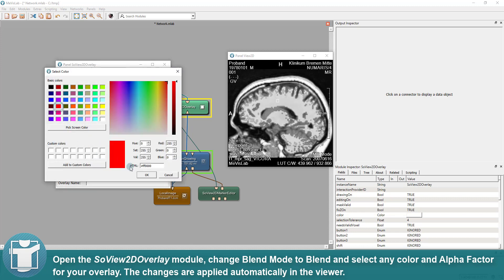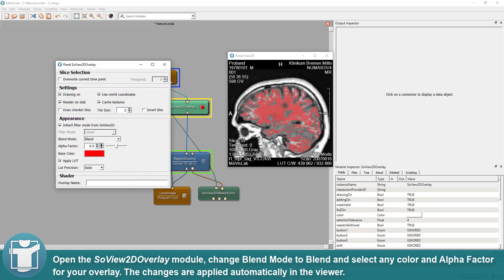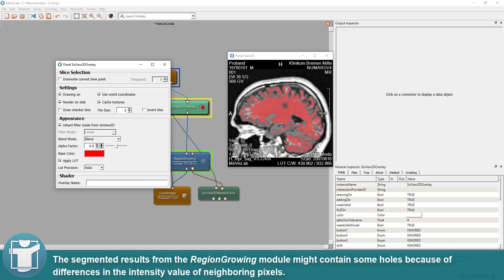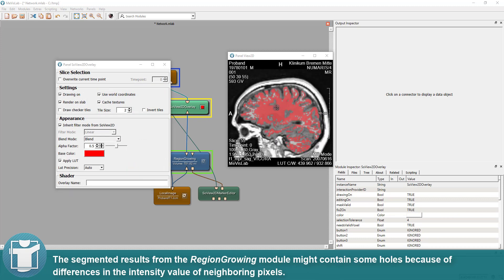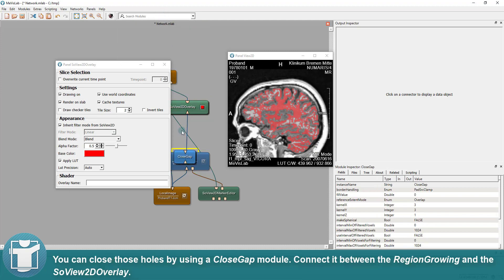The segmented results from the region-growing module might contain some holes because of differences in the intensity value of neighboring pixels. You can close those holes by using a close gap module.